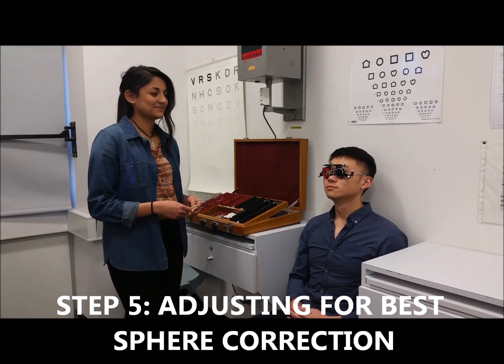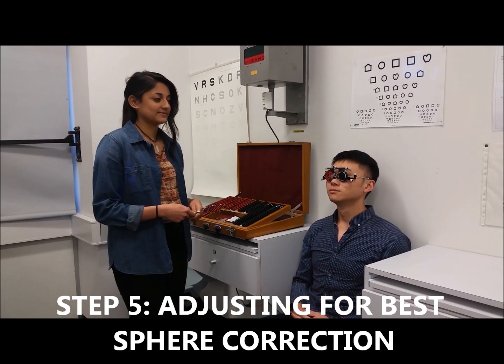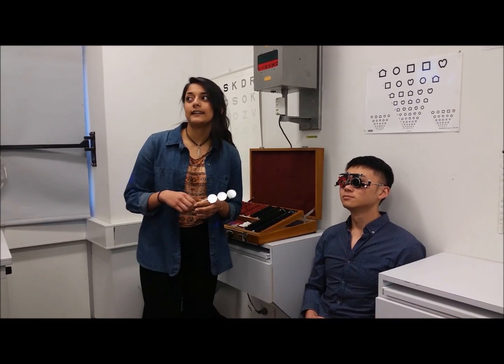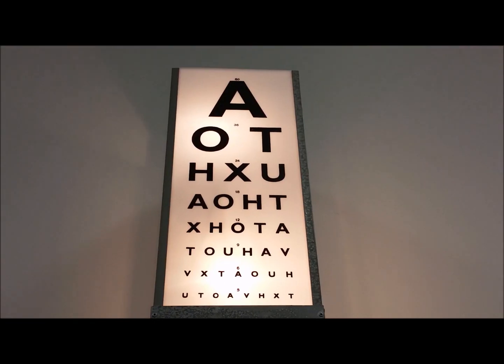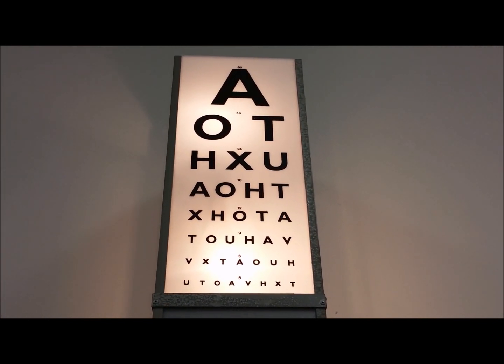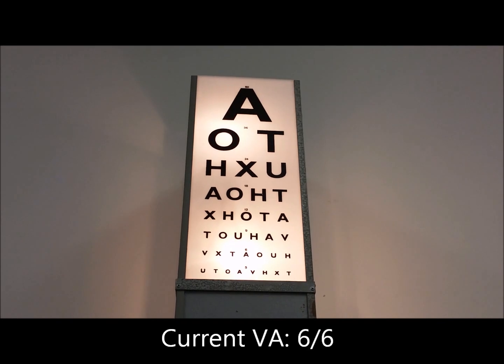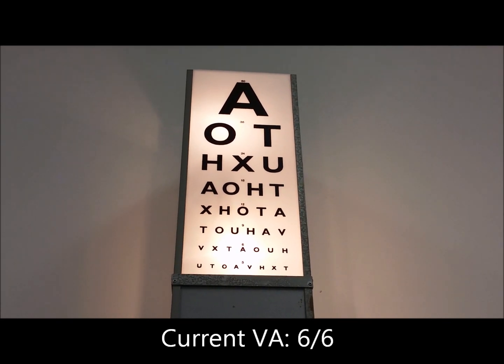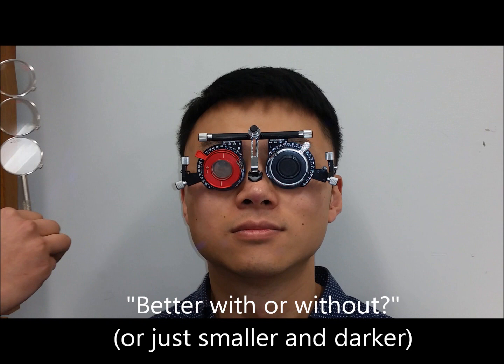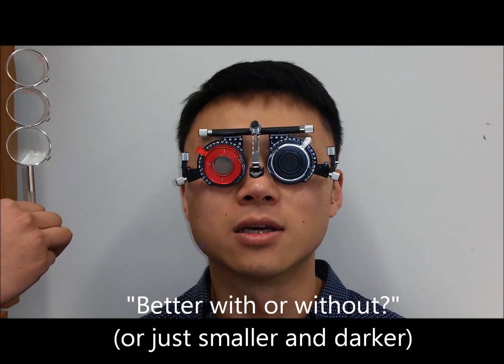Step 5. Adjusting for best sphere correction. This step follows the principles of step 1. Alright, Hongbin, so I'm just going to get you to read down to the lowest line you can read for me. V X T A O U H. Any further? No, I can't. So just looking at that A for me on the lowest line you can read, I want you to tell me, is it better with or just smaller and darker or better without? Just smaller and darker.